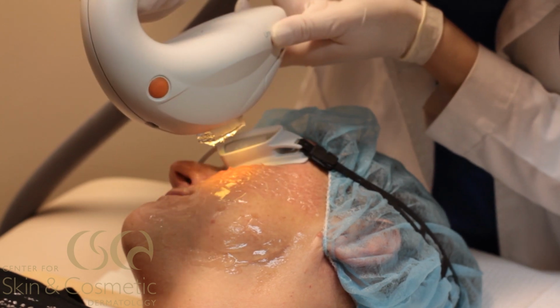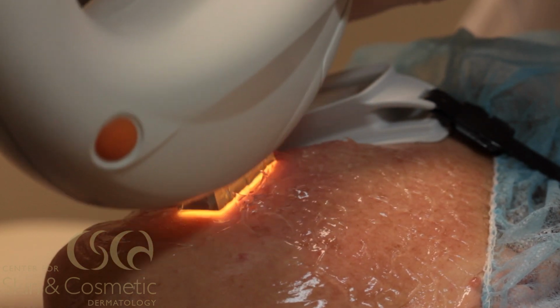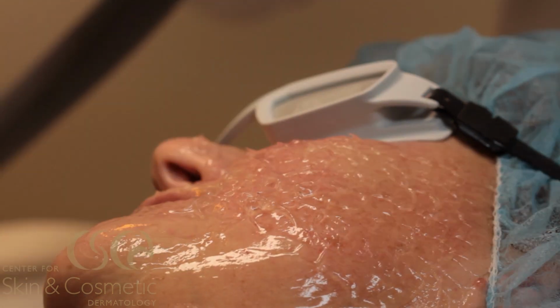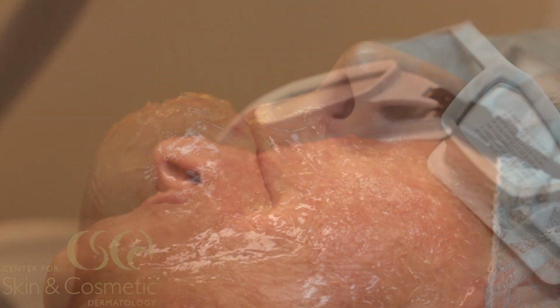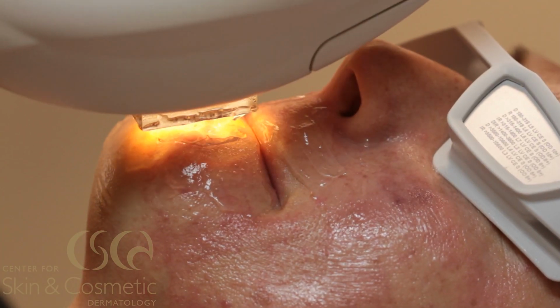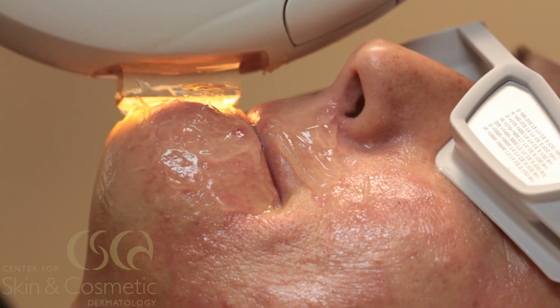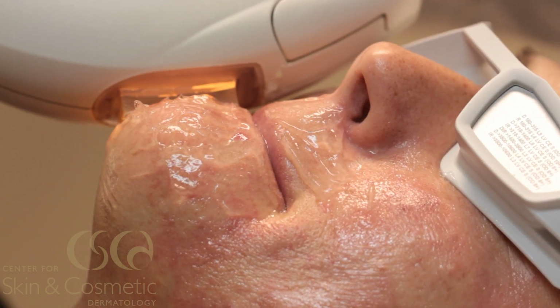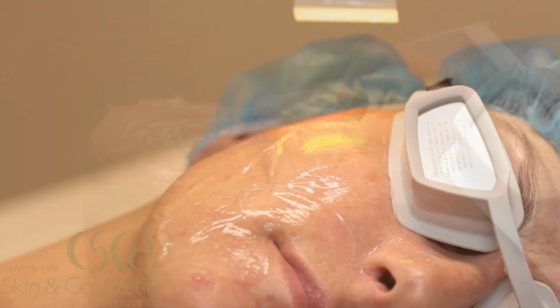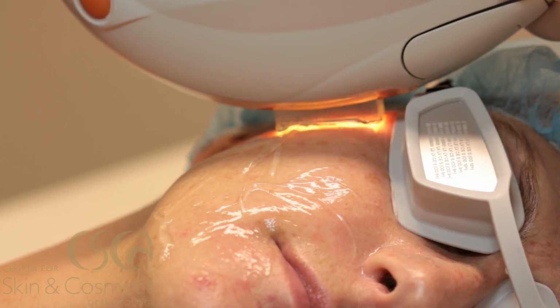Basically, when you're treating a patient with intense pulse light by itself or fractional by itself, when we combine the two, there is a synergistic approach that's happening within the tissue, and it allows us to achieve in one session what it would normally take 3 sessions to do with either modality by itself. Total treatment time for the intense pulse light portion of this procedure is going to run about 20 minutes. If you want to include the prep time and the cleanup time, that will add another 10 minutes. So a total of 30 minutes from beginning to end.